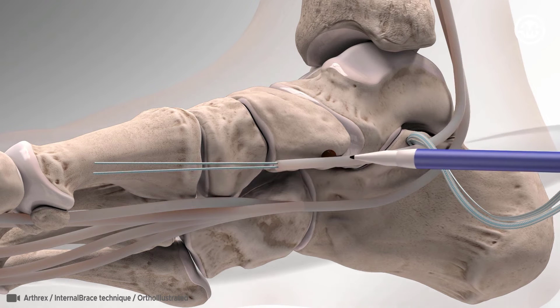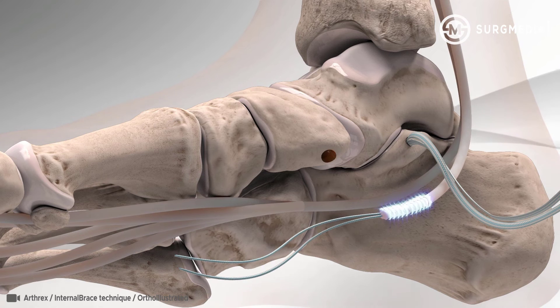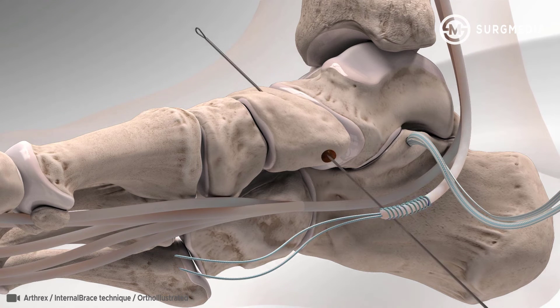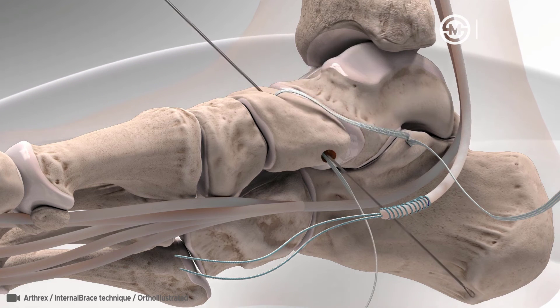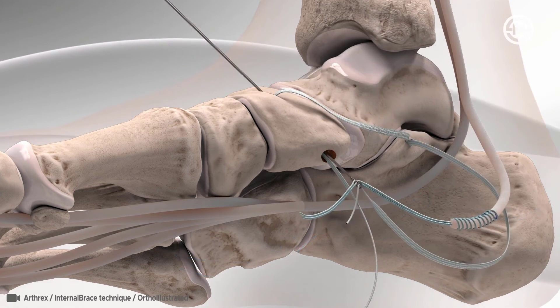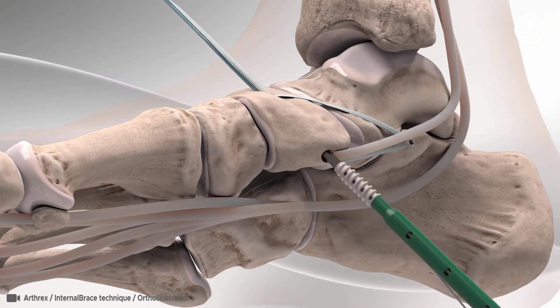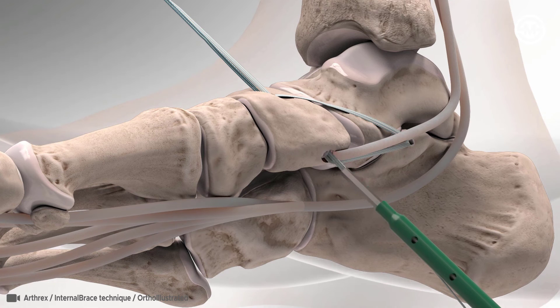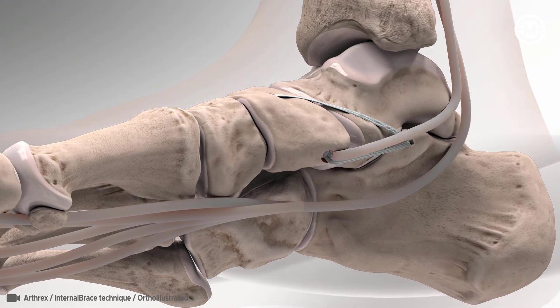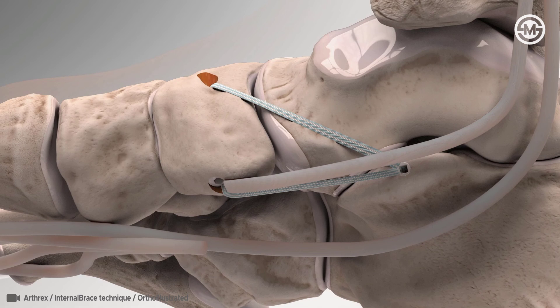The ankle structures are tensioned and fixed into place by taking one part of the fiber tape and passing it from top to bottom with a suture passing wire. Then the other part of the fiber tape with the sutures from the FDL tendon is passed from bottom to top. The surgeon holds it in place by inserting the swivel lock from bottom to top, and the remaining sutures are cut. The supporting structures of the arch of the foot are now repaired and held together with the internal brace, causing the arch of the foot to be restored.